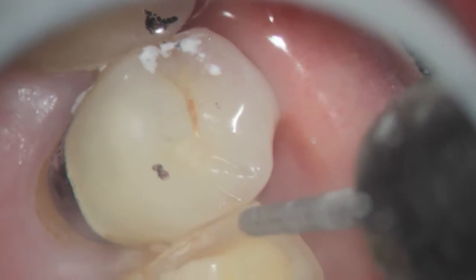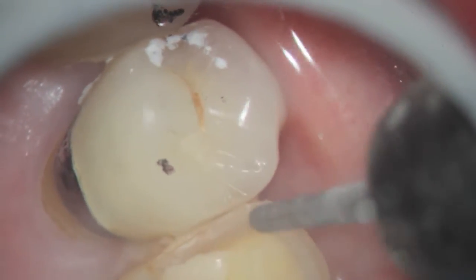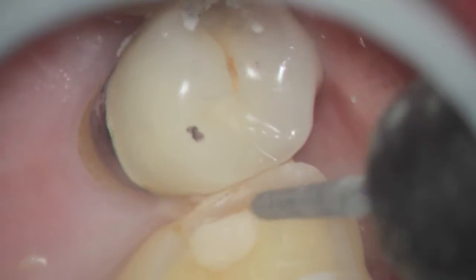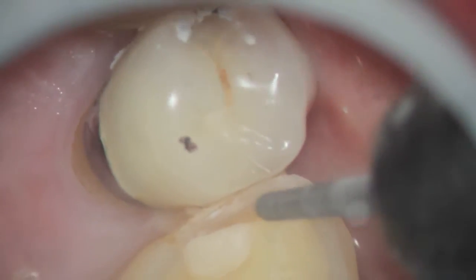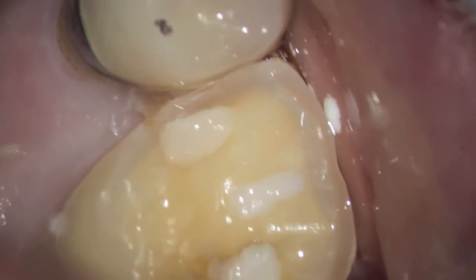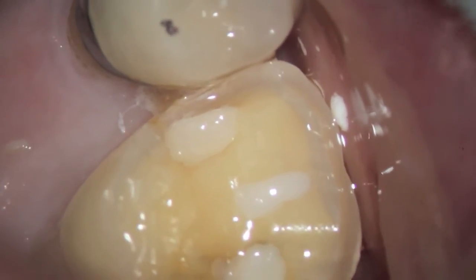This is a disposable diamond that allows us to have a little bit of thickness for the zirconium, and just a very light chamfer on the buccal area.